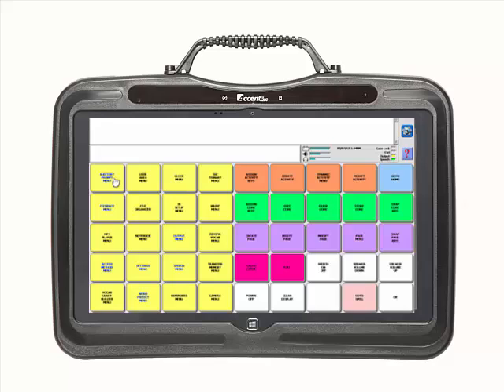The toolbox has yellow keys on the left-hand side and multicolored keys to the right. To exit the toolbox, use the light blue Go to Home key in the top right-hand corner of the screen.